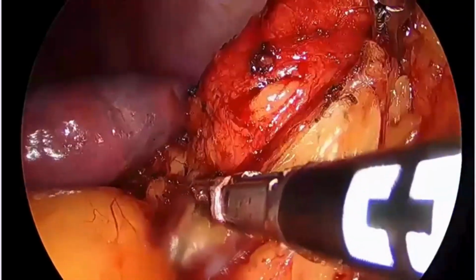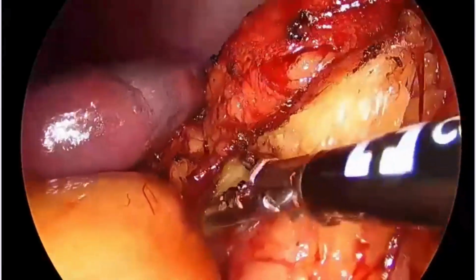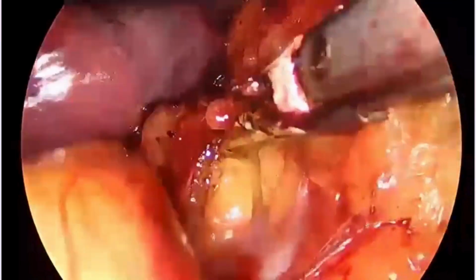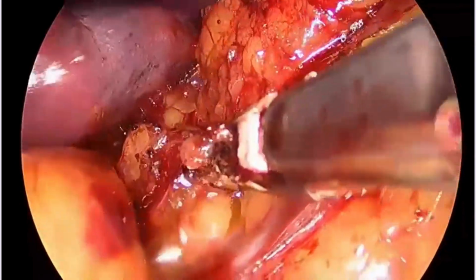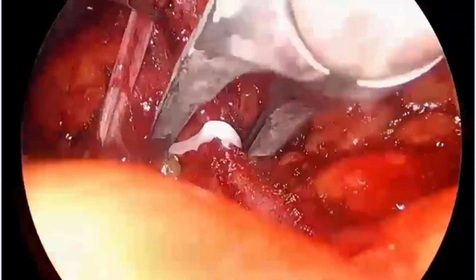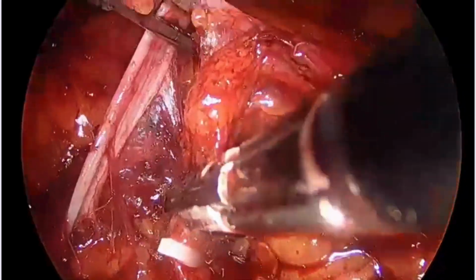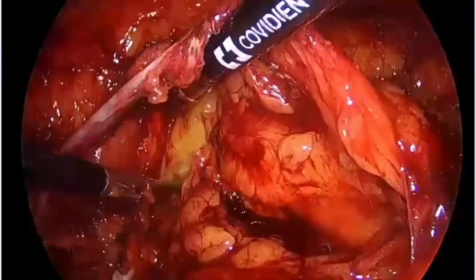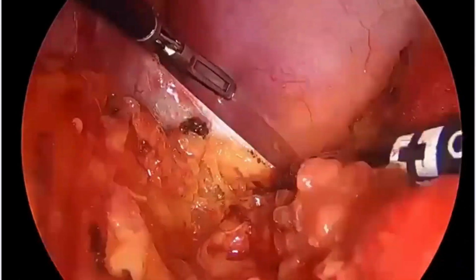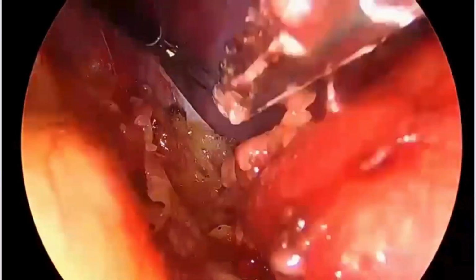And once the renal vein was identified, it was gently dissected, and then every possible effort was made to identify the renal artery. And as expected, because of adhesions, even this renal artery identification was very difficult. So we had to clip and divide and ligate every possible structure which was looking like a renal artery, because of multiple interventions and infections. Everything was looking like a cord around the hilum.